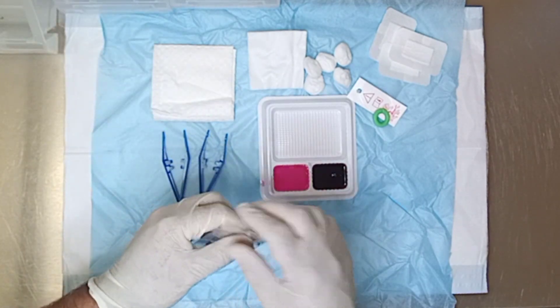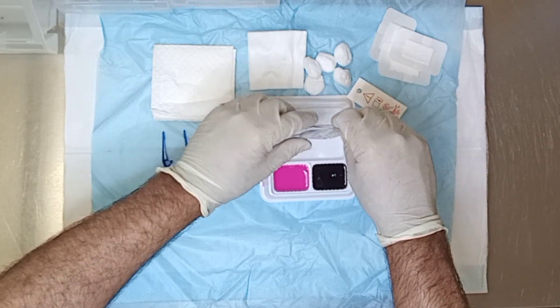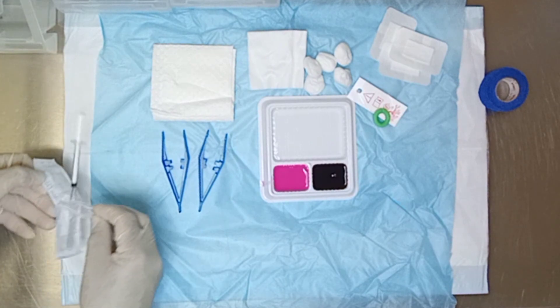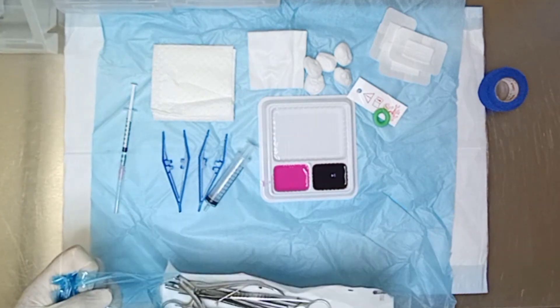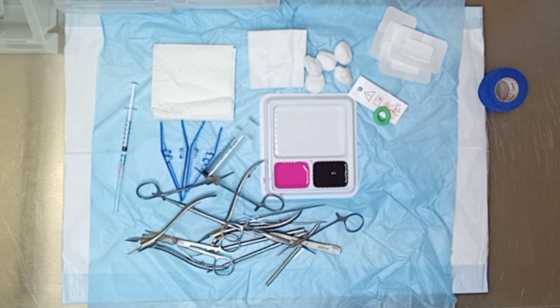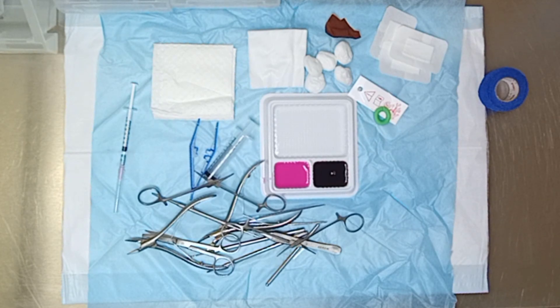Now we go through the saline, which is for the final flush — we pour that into the container. Make sure everything is clean, nothing is mixing, everything is nice and accessible. Even for patient presentation, they like to see everything clean and presentable. We've added the co-band. That's the phenol — a one mil syringe with a drawing up needle; I find that's the best way to apply phenol without it going everywhere. That's a 10 mil syringe for flushing with saline. Sterile instruments — I generally use two sets in case you drop one. That is a betadine swab, normally used for packing; I've been using it for many years and find it very effective — it doesn't stick.